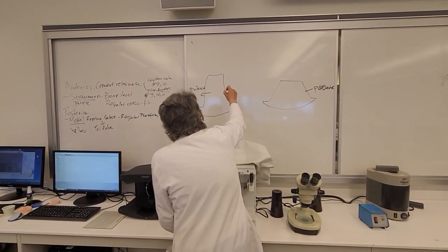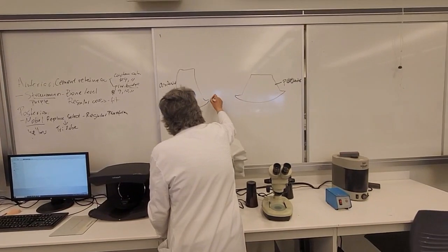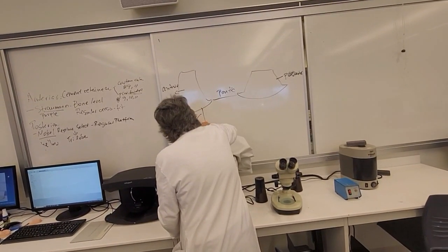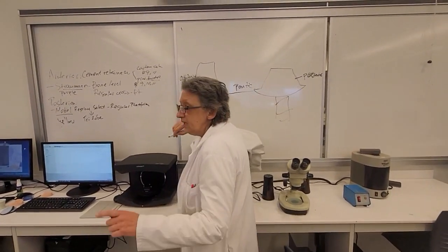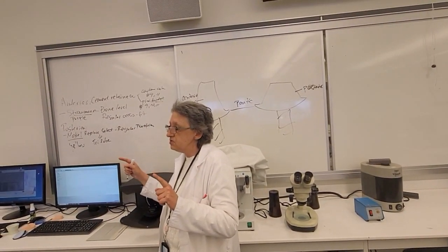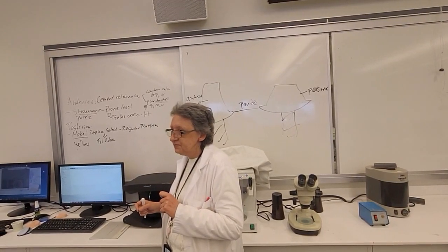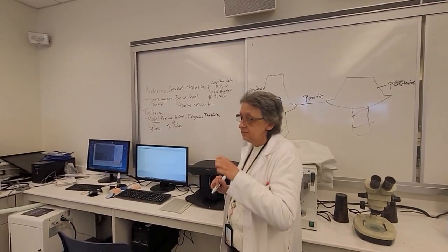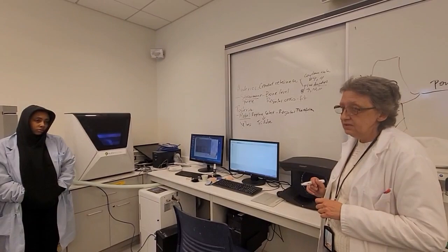So let's say these are my preparations, and I have a 3-unit bridge. So here I have a natural tooth, here I have an implant, another implant here. By the way, can I make a bridge and put an implant and a prepared natural tooth, and make a bridge on them? Your opinion, yes or no? No. Why?